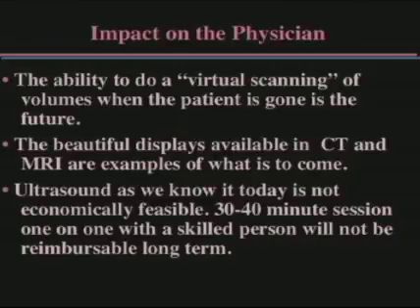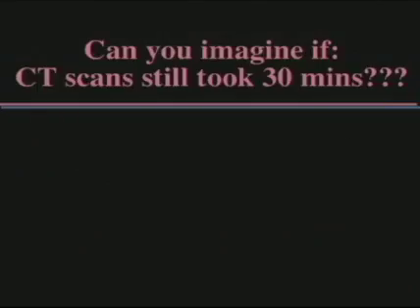And plus, once you have these volumes, the physician can then reconstruct any plane, even if it didn't happen to be a plane that the sonographer had planned to image, so that much more information is available within the volume than the information that was actually photographed by the sonographer.